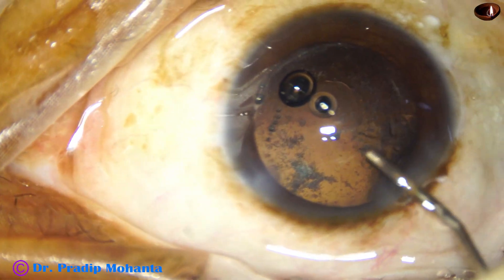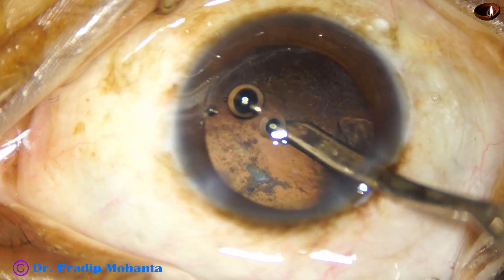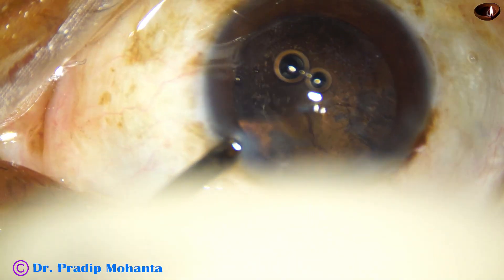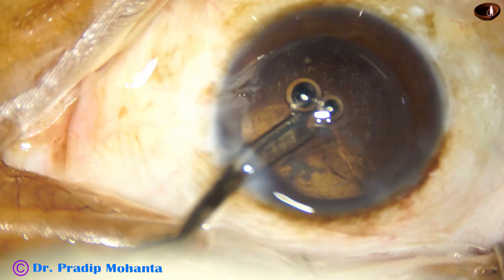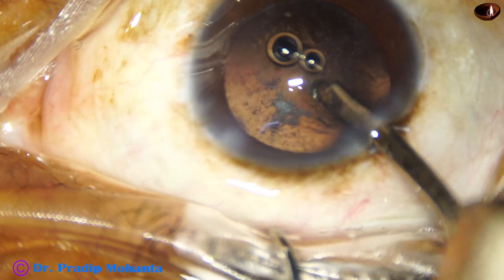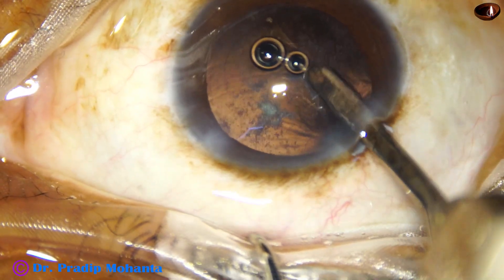Injected Visco. See, a lot of dirty things are sticking to the posterior capsule. Some are in front of the capsule, which I can touch. Some are on the back surface of the posterior capsule, which I can't touch. On the back surface of the posterior capsule there is some silicon oil — small silicon oil particles — and some dark black pigment-like things sticking to the posterior capsule, which I can't clean.